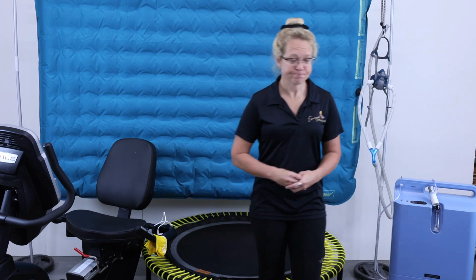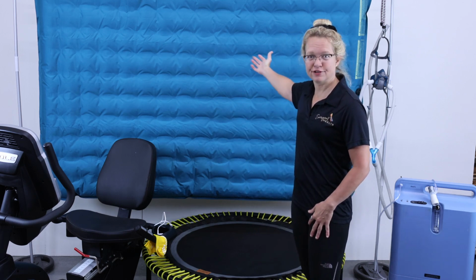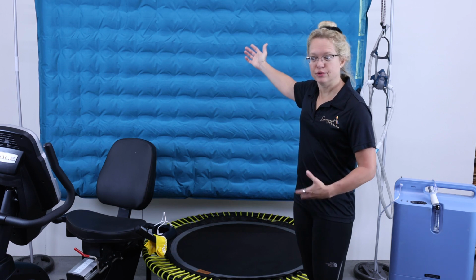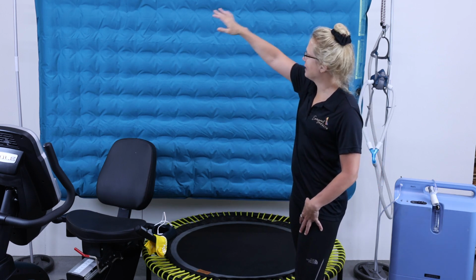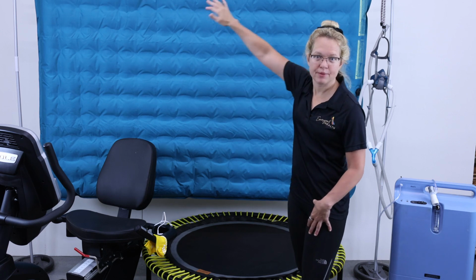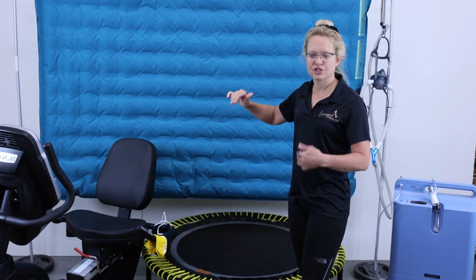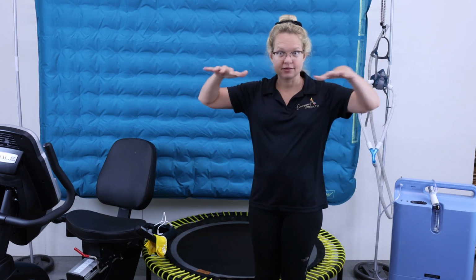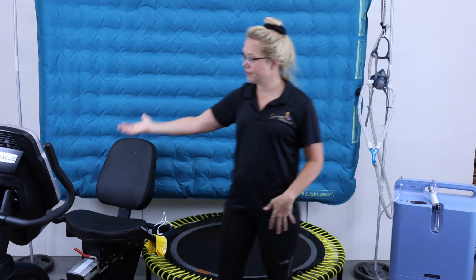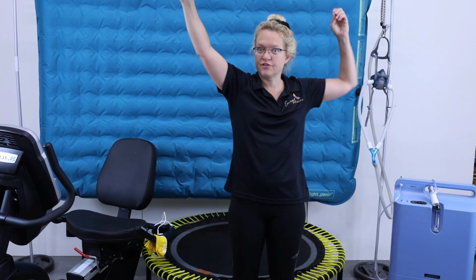So first of all, the biggest thing here in the picture is an inflatable mattress, like you would use if you had a guest coming over to stay. And I'm hanging it from a little stand, from 2 tripods, but you can hang it from anywhere. A lot of people hang it from the ceiling, flat, horizontally, above their exercise equipment. So it's completely out of the way.